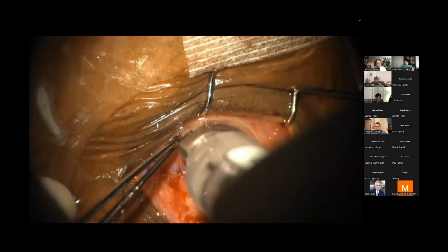But I always worry about putting too much fluid in the anterior chamber for the fear that it may go back and lift up the retina a little bit.